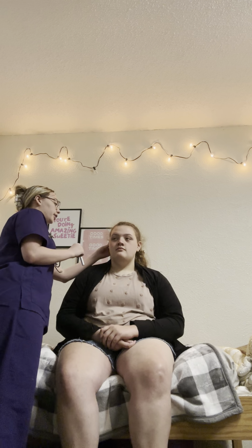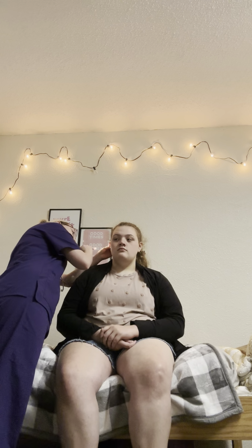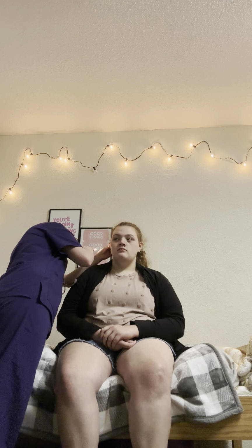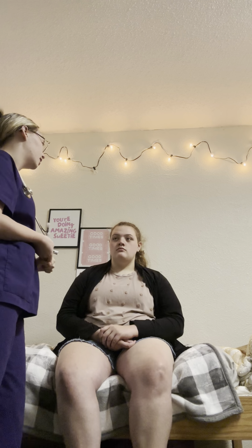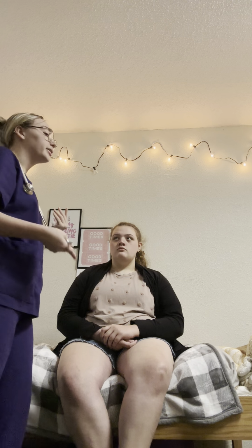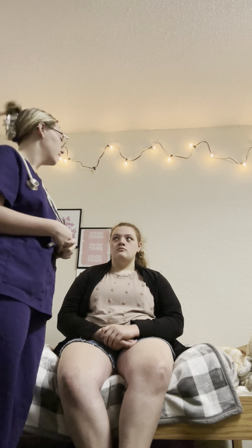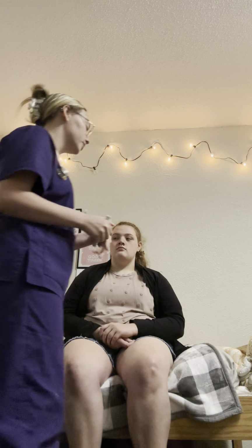Then I'm going to pull her ear up and back. I usually have an otoscope that I would use, and I would inspect it. We're going to use our pen light today as best we can. I didn't see any impacted cerumen. You seem to have very good clear ears. There was a little bit of hair, but that is normal, as that helps people to hear in the ears and should not have any problems. I'm just going to check the other side real quick.